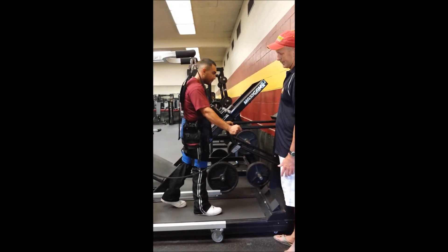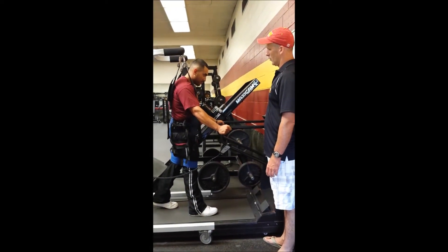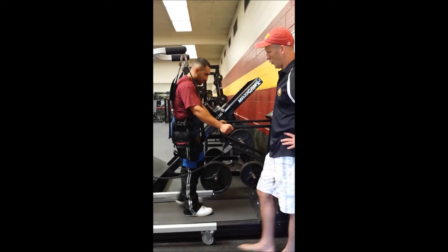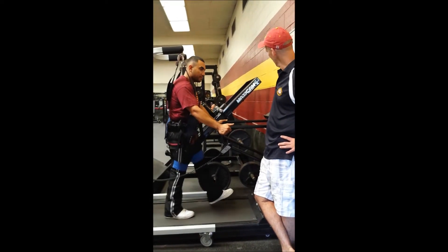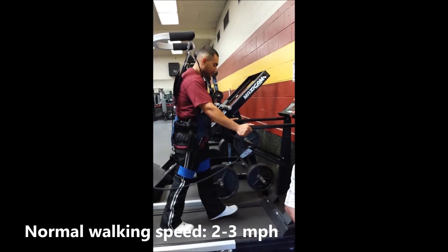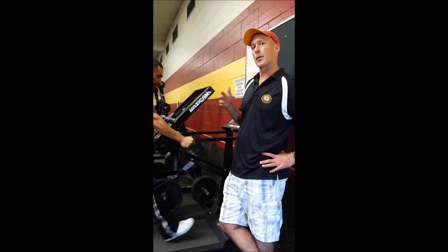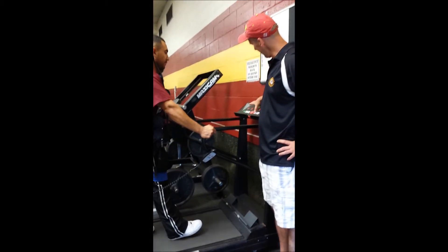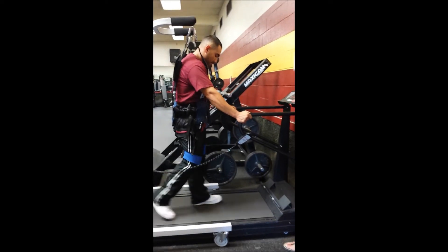That's five times slower than a regular treadmill would start, and actually for most folks, walking slower is more difficult than walking at a normal gait speed. So we're going to bring up the speed — this would be the normal starting point of a treadmill. A normal walking speed is anywhere from two to maybe three and a half miles per hour. Generally, as you approach two miles per hour, some folks' gait will actually improve — which might be counterintuitive, since you'd think slower is better, but that's not always the case. I'm going to bring this up to 1.2 miles per hour.